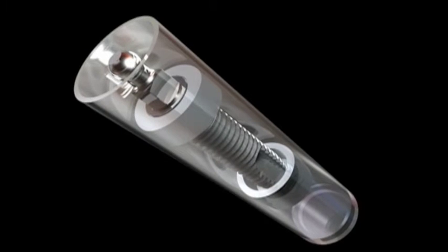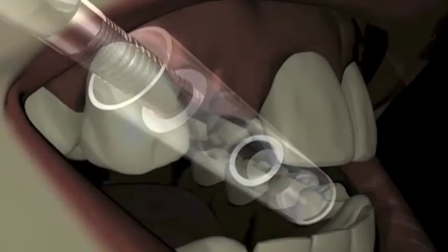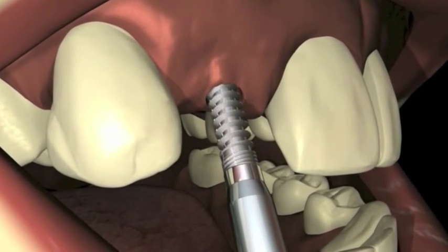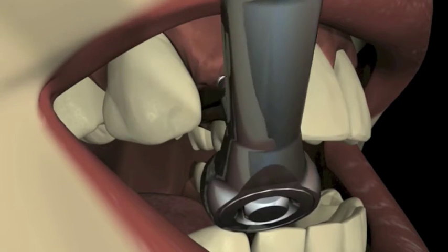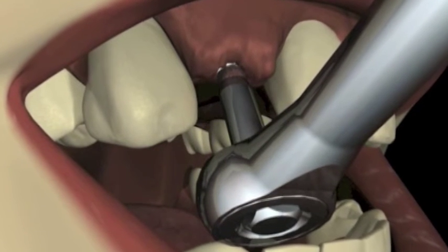A contra-angle driver attached to a slow-speed handpiece slips over the O-ball, removes the implant from its sterile packaging, and transfers it directly to the surgical site for seating at 15 rpm or less. A surgical ratchet with a ratchet driver can be used to accomplish the final seating stage. The ratchet driver is also available in a long-shaft version for clearance in narrow spaces.